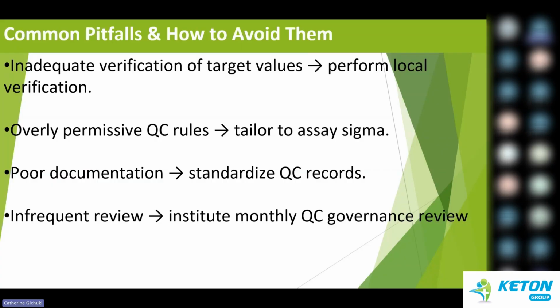So the common pitfalls that we usually fall into: these are the common mistakes that labs make with QCs, and simple actions to prevent them from recurring. The first is inadequate verification of target values. This is just not setting your own QC target.